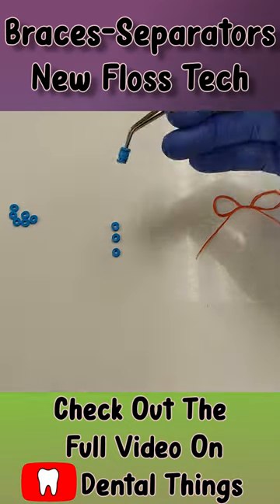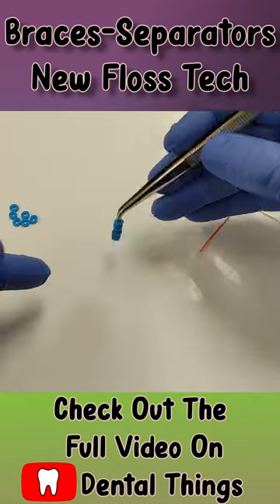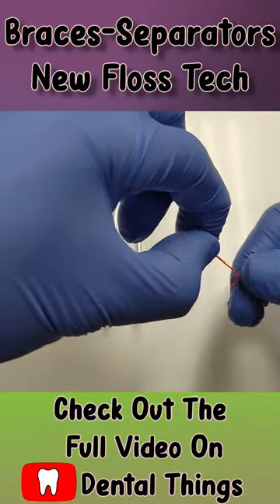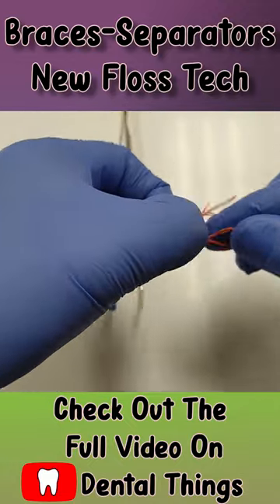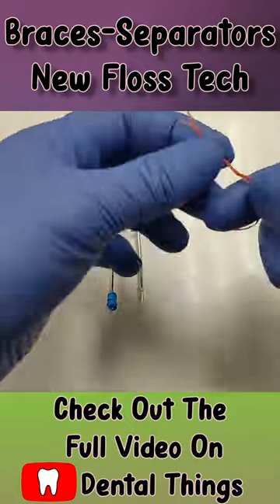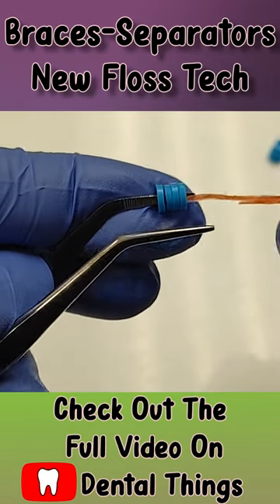If you need to do ortho separators, here's a quicker technique to get them on. Collect all the separators that you need, take your floss and unravel it — you only need one strand. From there, tie two knots into your floss so that it makes a complete circle, then load all of your separators onto the piece just like so.